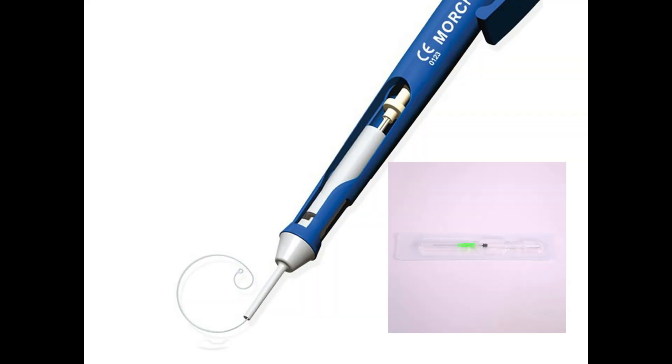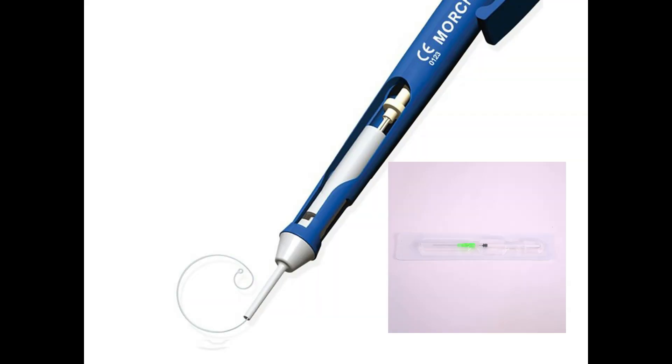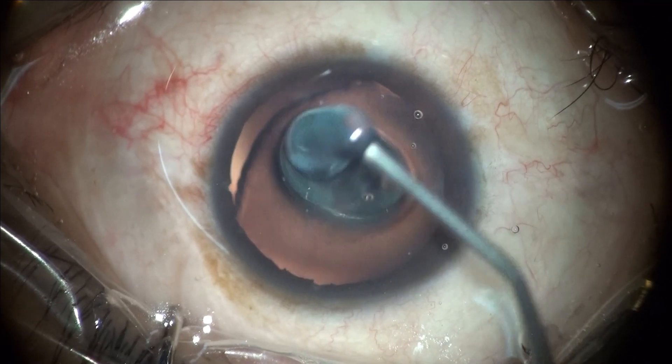If you have access to a CTR injector, I think it might be an easier way to inject the CTR.